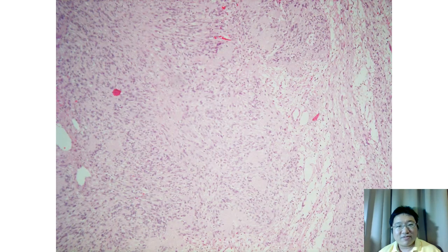Here is another picture showing the syncytial growth and also the whorling pattern. And sometimes we may observe intranuclear inclusions also, but that is fine. I think it is too much detail.